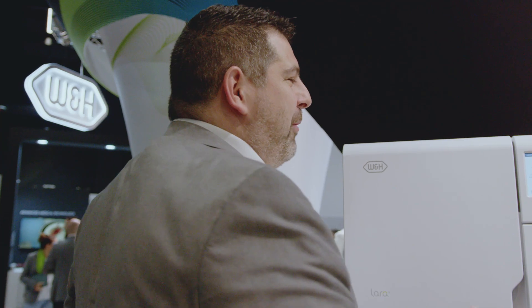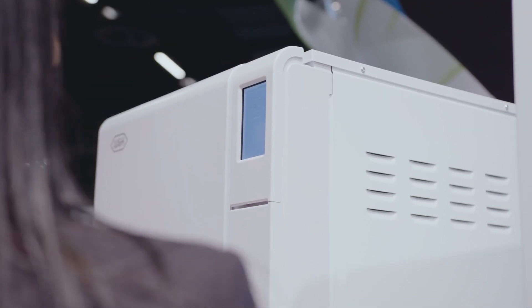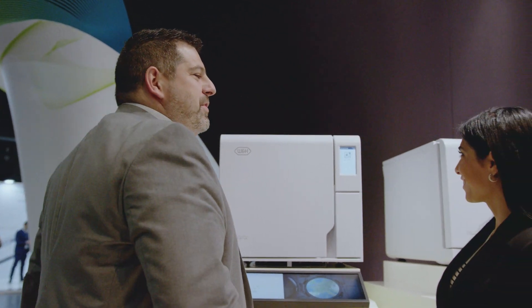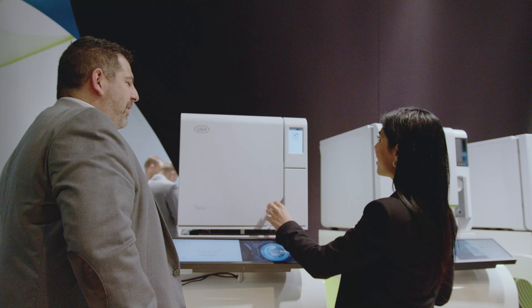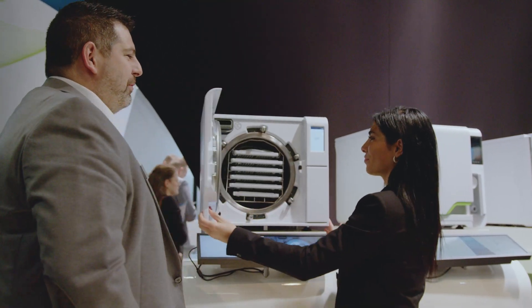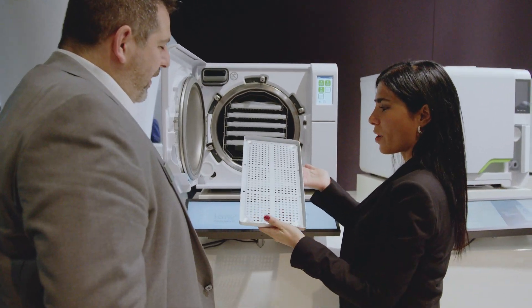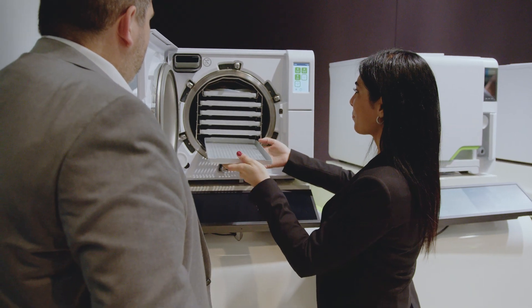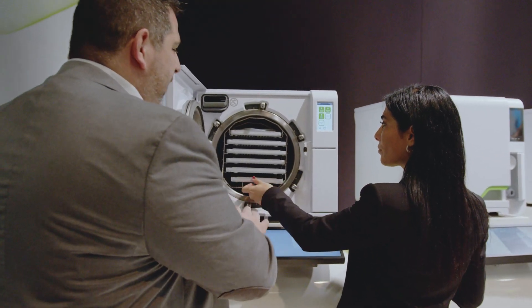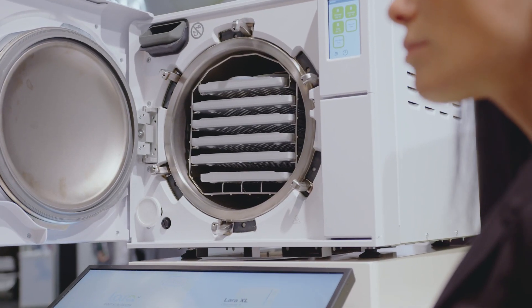To show again how really simple it is to use, you just have to follow what is written in the menu — just unlock the door. This is the tray where you put your load. This device has six trays by default: four larger and two smaller.